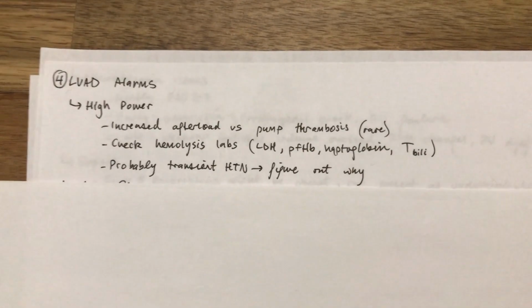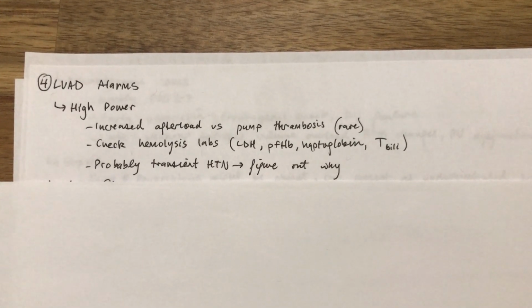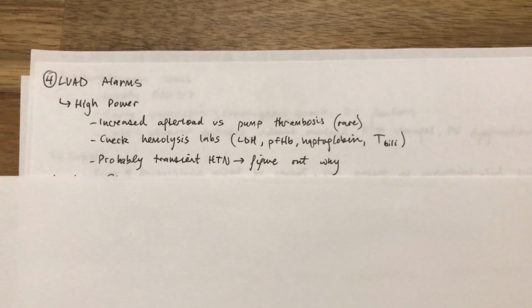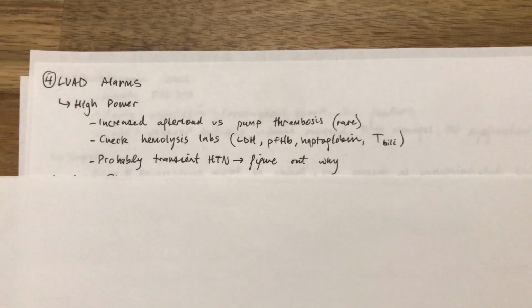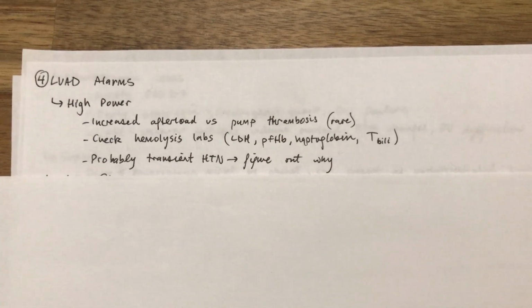We'll move on to the alarms next, starting with the high power alarm. What you really need to know with the high power alarm is whether this is due to transiently increased afterload. Is the patient intubated and agitated? Are they valsalvating? Are they in pain? Are they constipated? Is it something like this, a simple ICU issue, or is it a pump thrombosis?